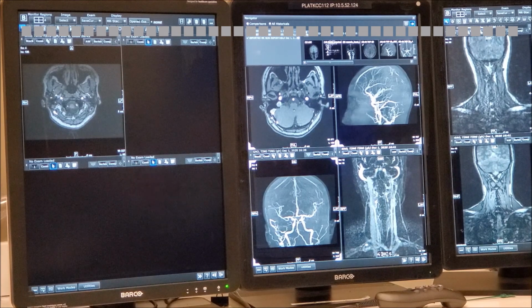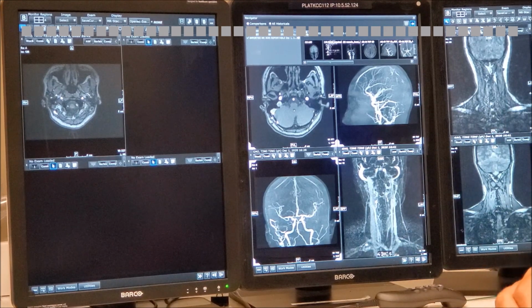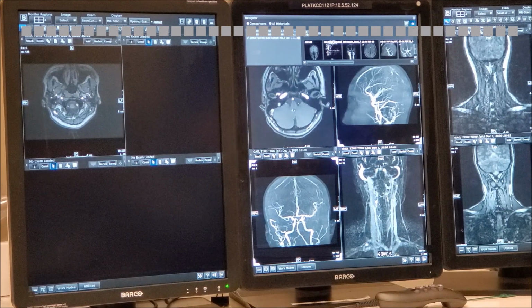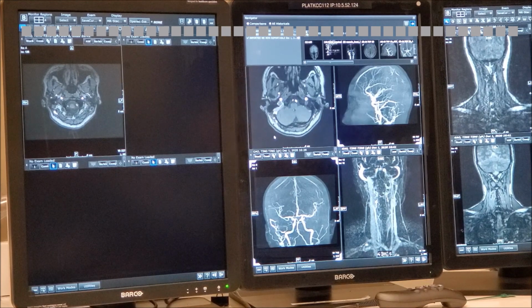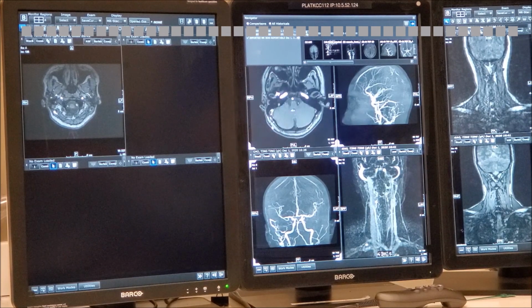but the dural AVM of the sinus is a post-thrombotic phenomenon. So there has to be thrombosis of the sinus as a precondition to the shunt to occur. So you look and you try to find if there is any evidence of thrombosis in the sinus. And we start seeing something that looks suspicious that you don't see on the other side. You see what I'm talking about? And then you see the hyperemia, tremendous hyperemia, right? Okay.